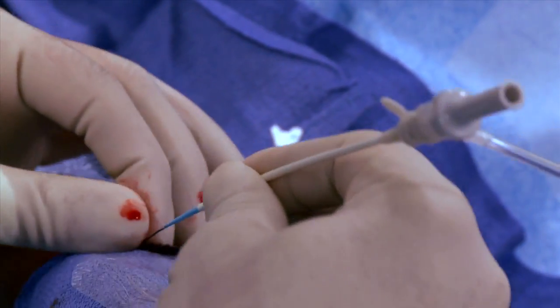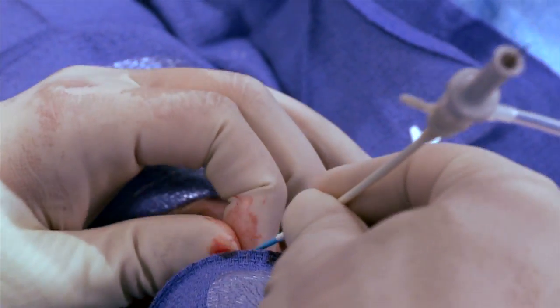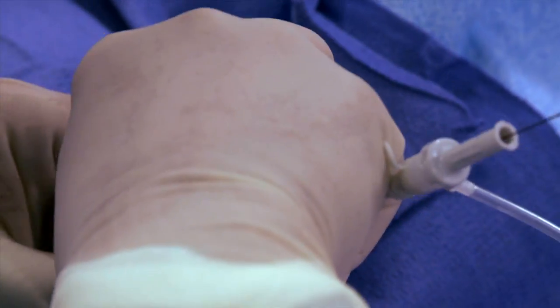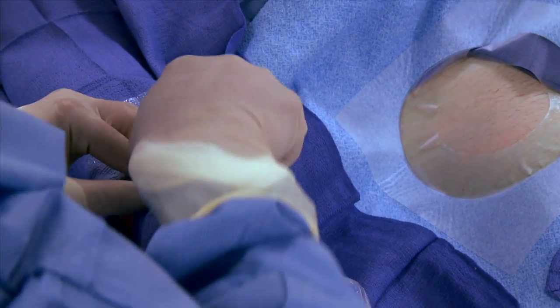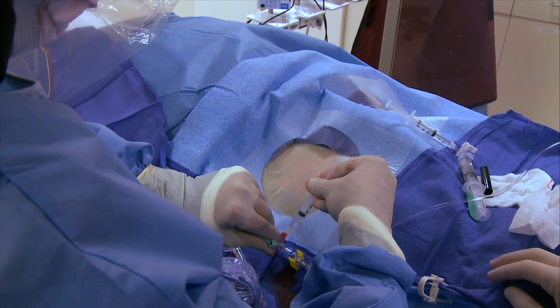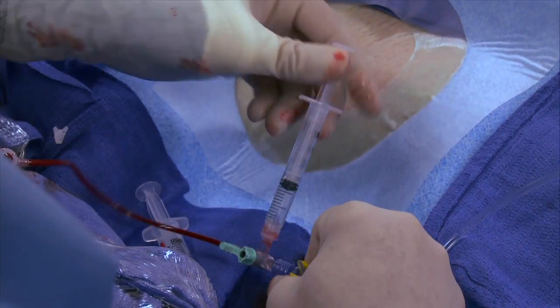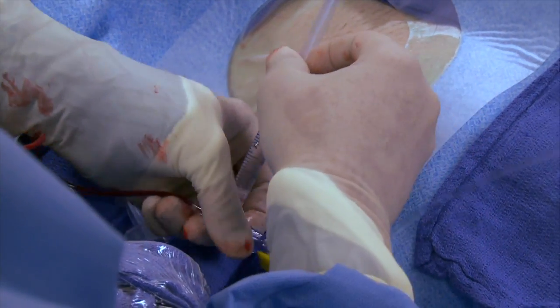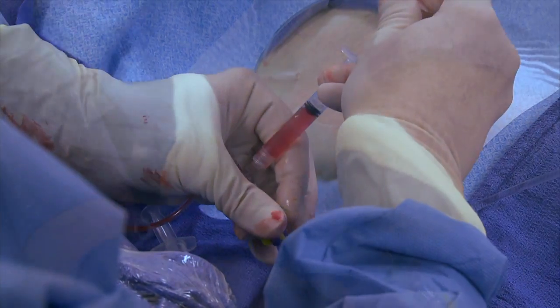An arterial sheath is then inserted into the wrist artery. You may feel a small amount of pressure during this portion of the procedure. We then administer medication through the sheath to avoid any spasm in the artery. This helps avoid any discomfort during the procedure.